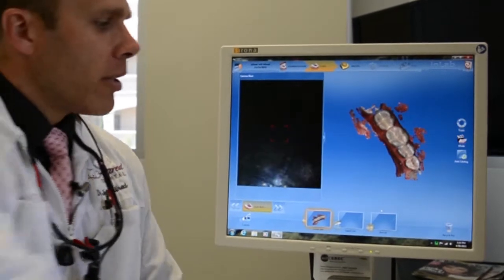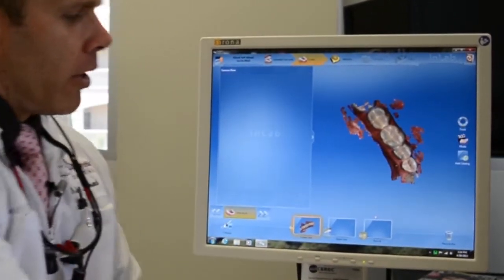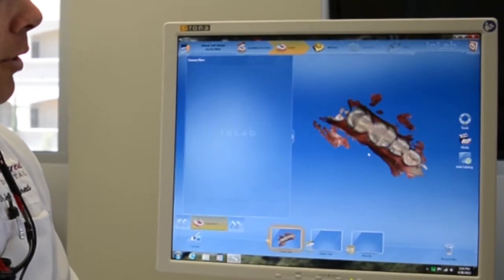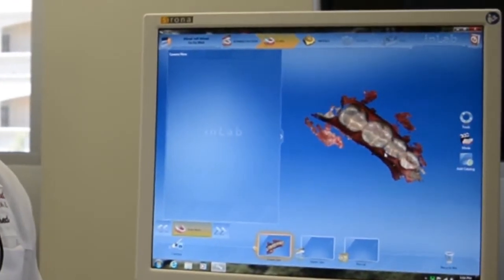So that's a 3D rendering of my lower jaw. And now we can actually manipulate it, show the contours that exist. And if we wanted to go ahead and copy that for a future crown, we could do that.